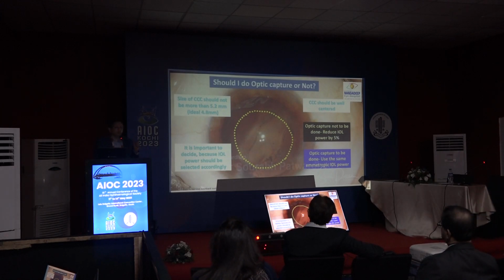Now, for doing good optic capture, the size of the CCC should not be more than 5.2. Ideally it is 4.8, and it should be central. If it is too decentered, just decide beforehand: I'm not going to do any optic capture.